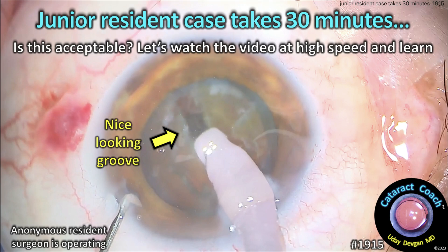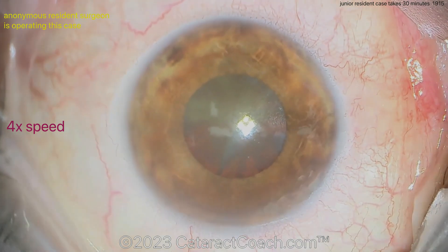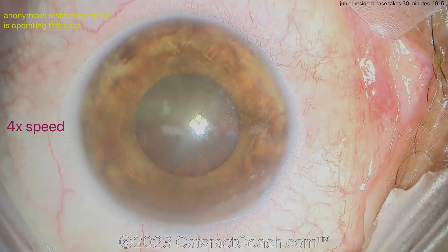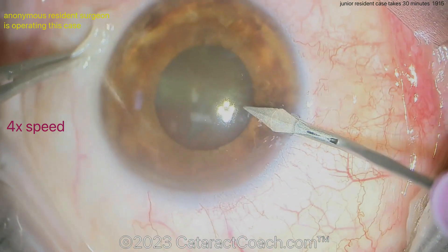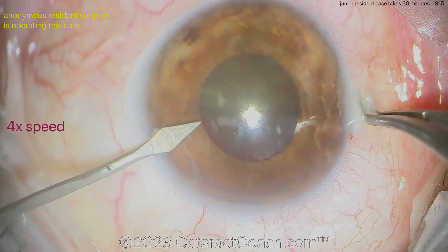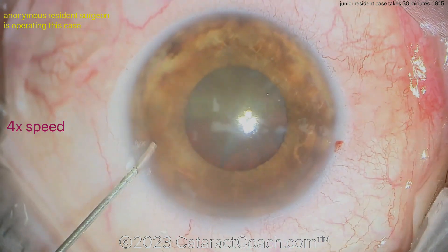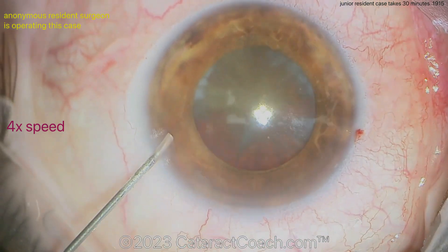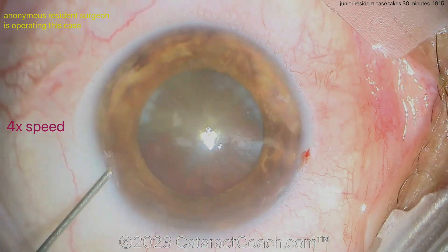From cataractcoach.com: a junior resident case takes 30 minutes — is this acceptable? Let's watch the video at high speed and learn. We have an anonymous junior resident who's operating. This is a tough case for a junior resident who has completed maybe 10 to 30 cases. Starting off with two paracentesis incisions. The surgeon is sitting superiorly and appears to be putting some anesthetic or mydriatic agent inside the eye to improve the pupil.